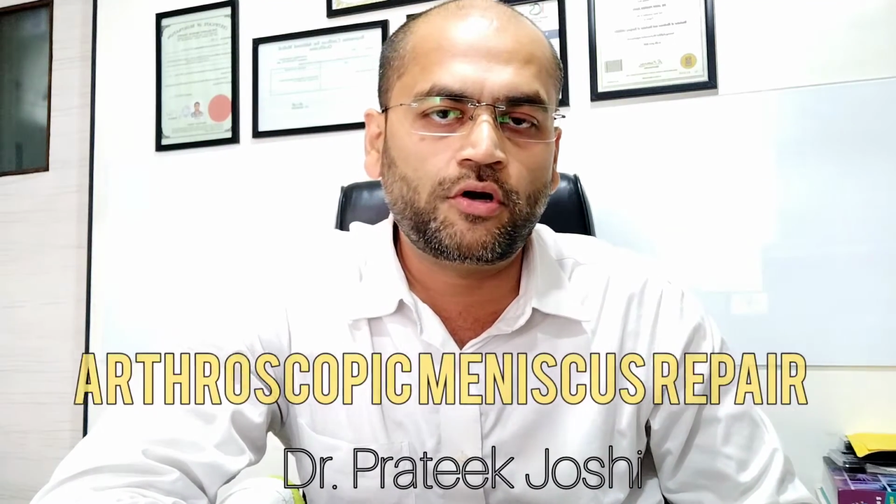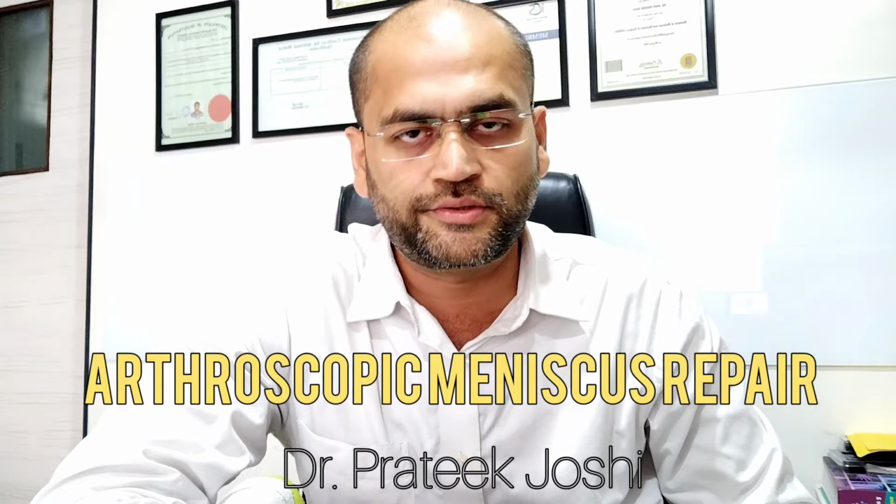Hello everyone, I am Dr. Prateek. Today I am going to show a surgical video of arthroscopic meniscus repair surgery.